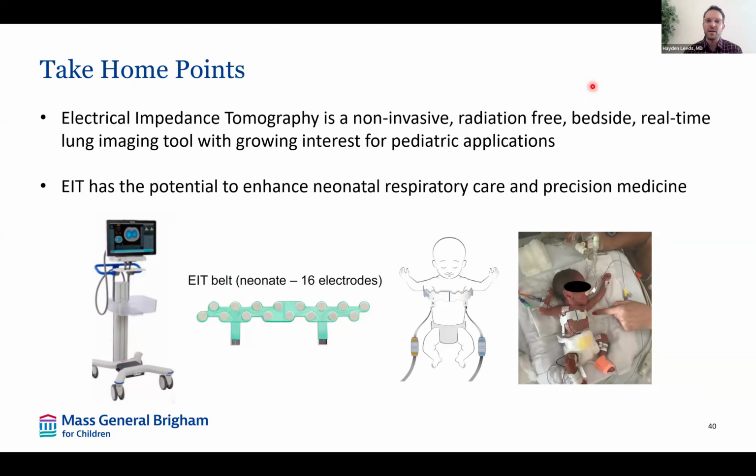It looks like we have several questions in the chat, so we can open it up for discussion. The first question that came in is, when you were presenting the series of patients that you were doing the BiPAP to CPAP weaning, was the position of the patient constant between BiPAP and CPAP, or were there changes in positions? Yes, it was constant supine. Because certainly changing positions would change the gravity-dependent recruitable lung areas. Great question. Definitely. Some of the work out of Dr. Amato's group has shown that you can do tilt tests and show that the ventilation and perfusion will alter as you change the position of the patient.